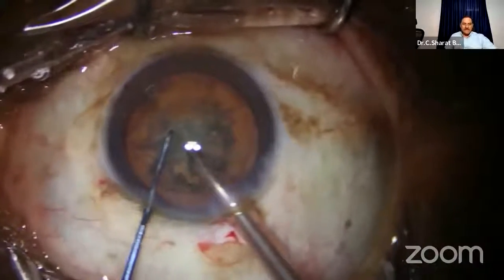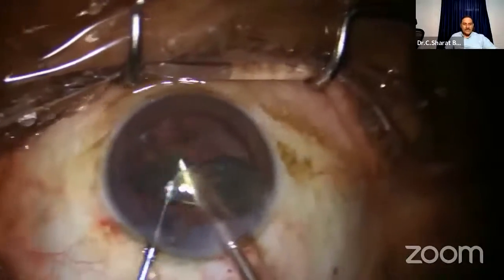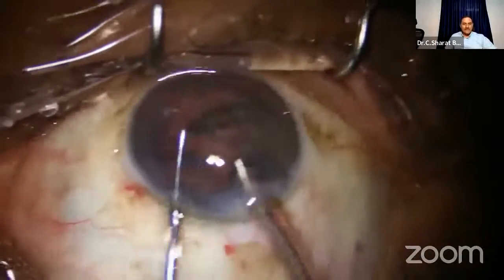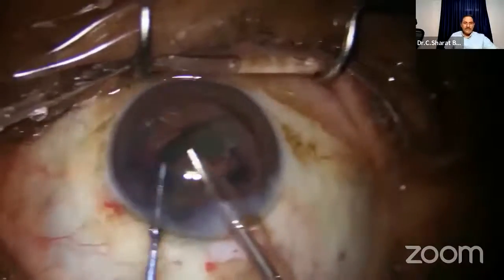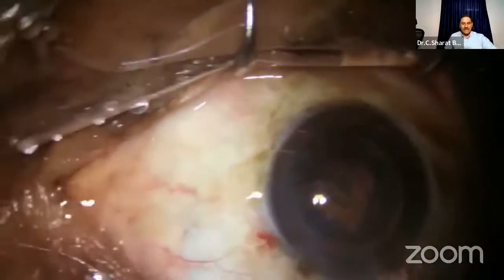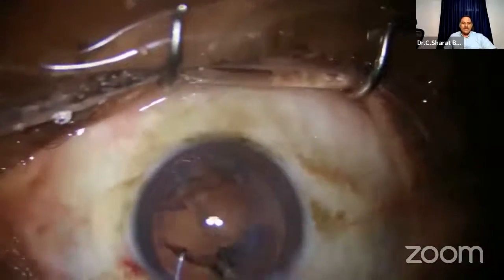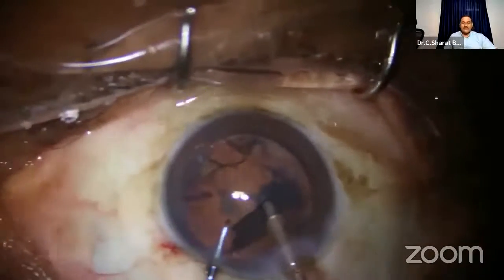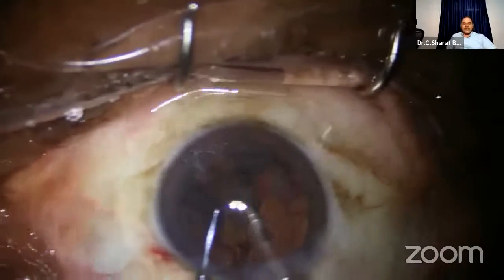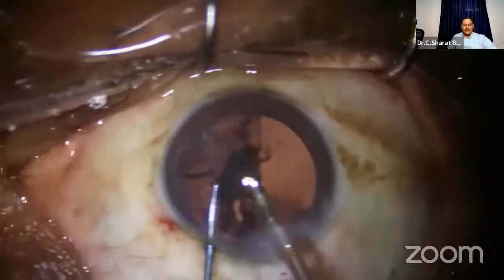The second most important part is during phaco. Because there is a lot of vibration, usually I operate under 50 or 60 intraocular pressure, but here I have gone up to 75, 80 during the phaco and even for the IA procedures. This prevents the posterior capsule from coming near the phaco probe, so I could do the phaco and proceed with the IA also in this patient.